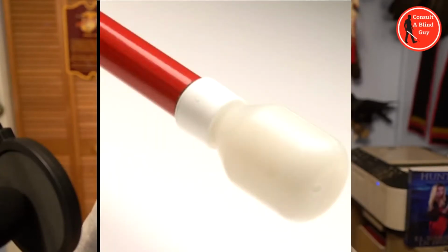And those are all the cane tips that I've purchased this past week to be able to cover here in today's video. There are a couple that were back ordered, unfortunately, so I was not able to get them on hand to be able to show them and give a little bit of a description on what they are and what they're good for. However, you can see here that the high mileage tip is very similar to the marshmallow.